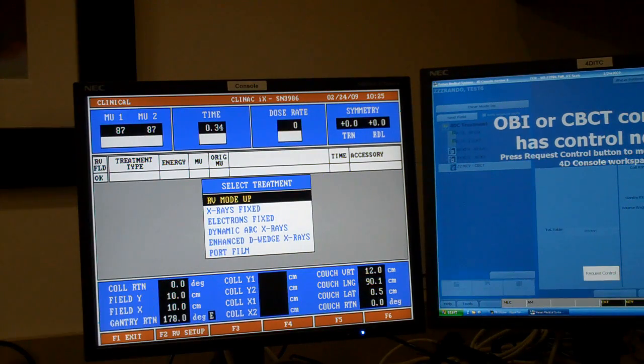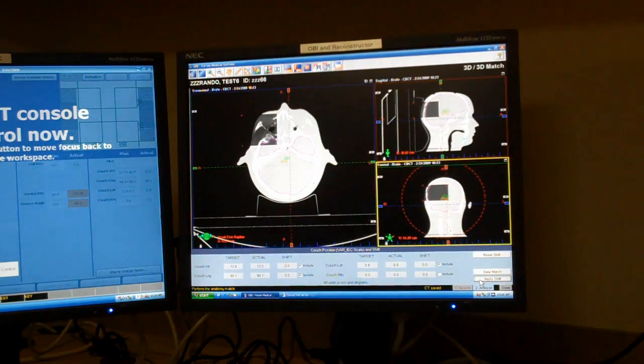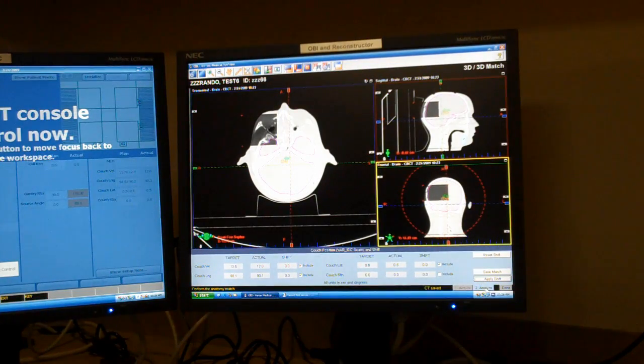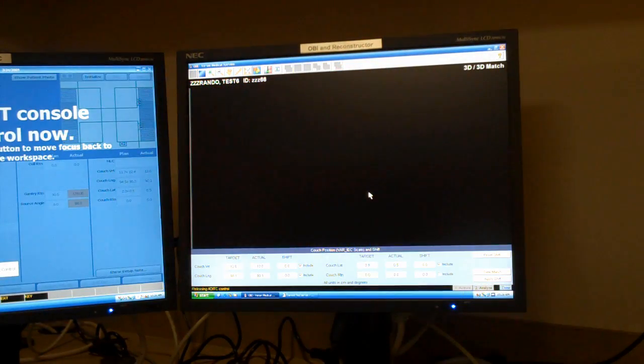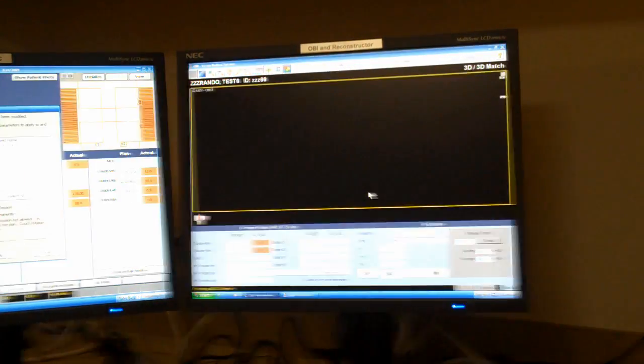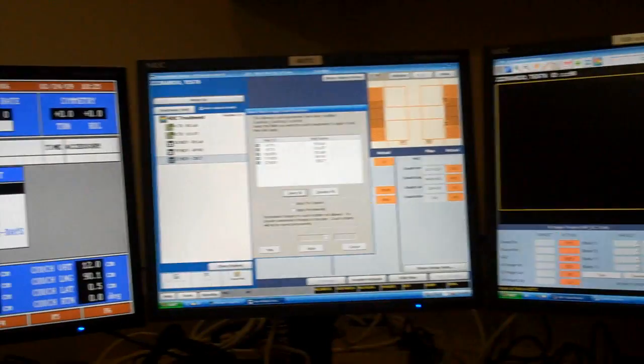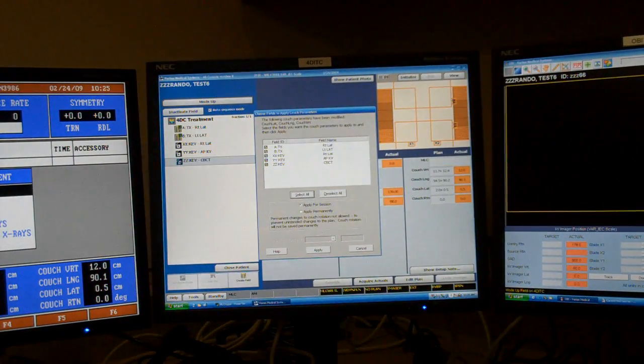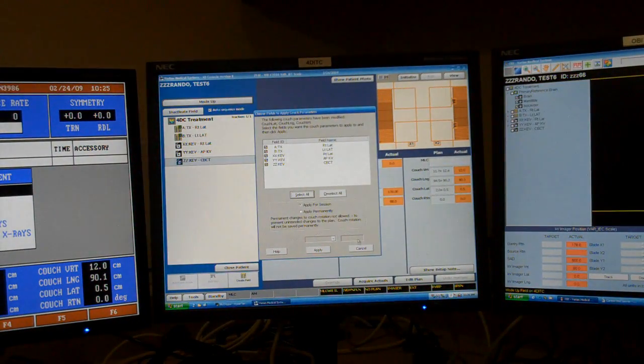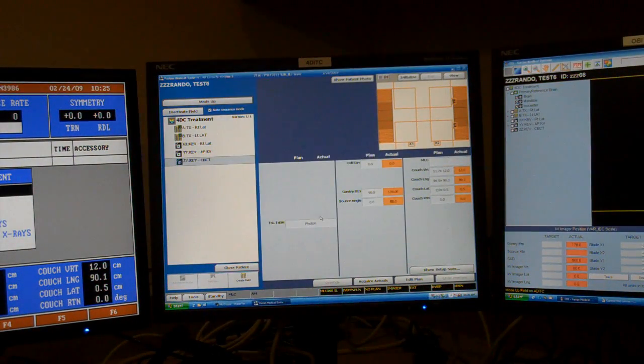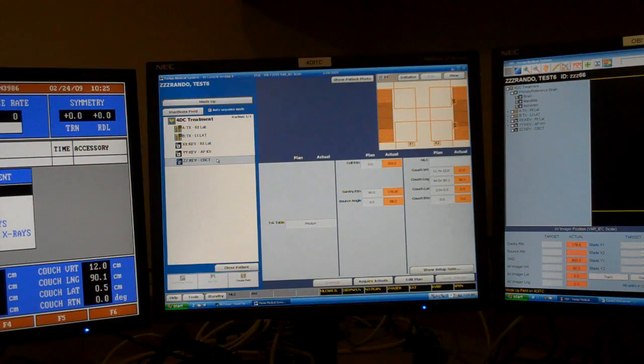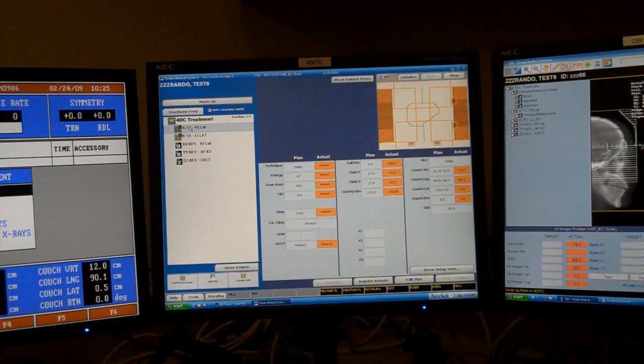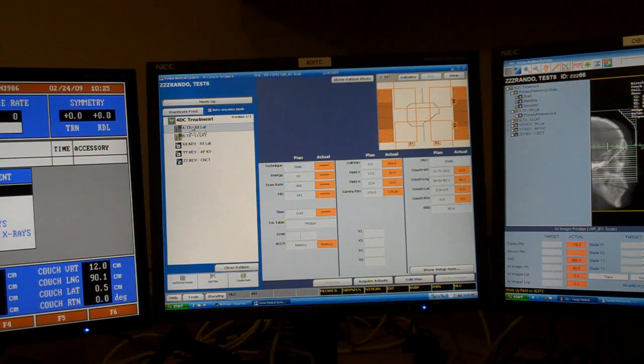And that's all there is to Cone Beam CT. Afterwards, you click done. You can apply your new couch coordinates for the session or permanently. And then, load your treatment field and start delivering.